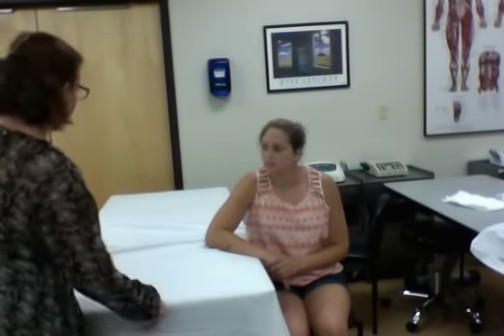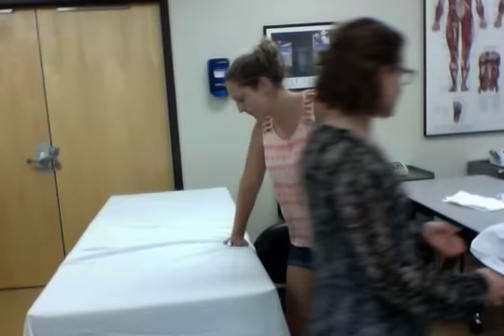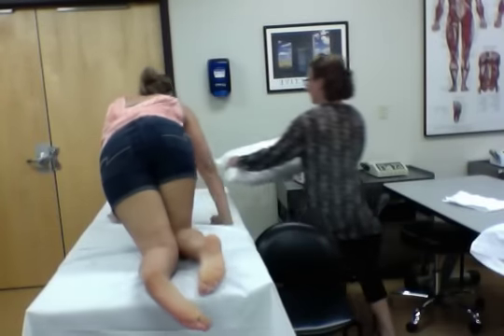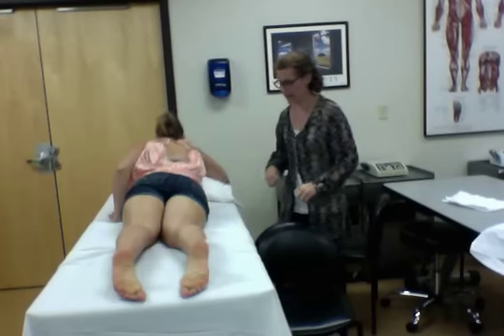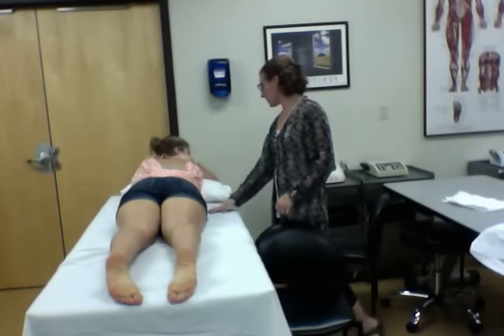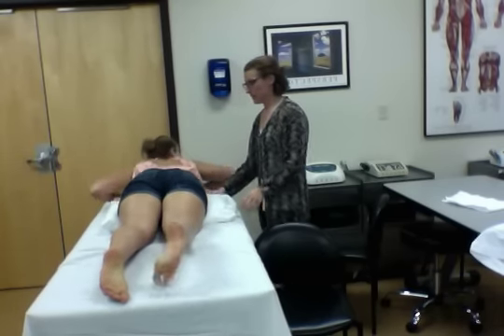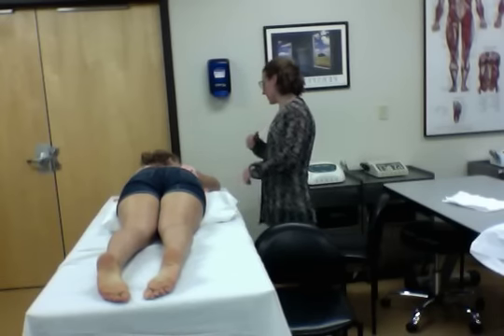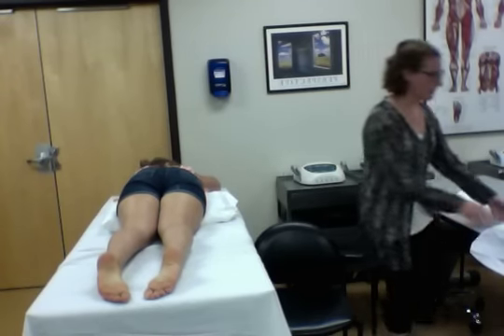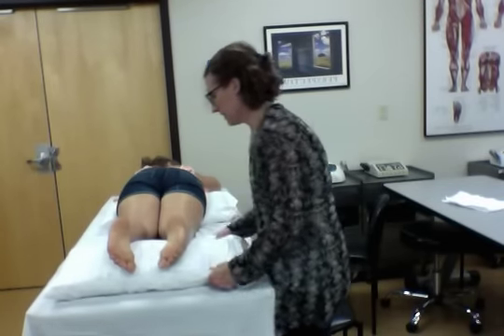All right. So JC, let's go ahead and get you set up here. And what I'm going to have you do is lay on your stomach with your head facing that way. Is that comfortable with your low back, or would you like something? Would you like this under your hips? Let's try that. That's better. And would you like something under your head? No. Okay. Then I'm going to put this pillow under your feet here, so it's nice and relaxed.